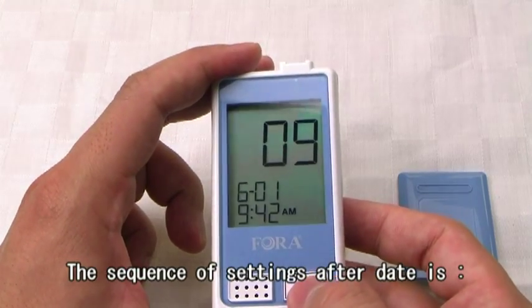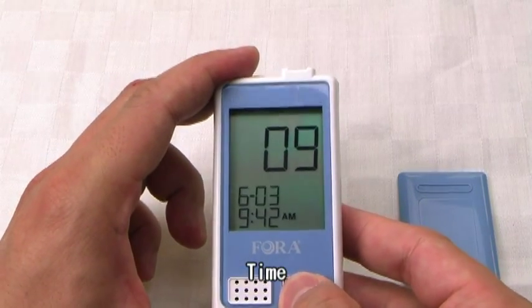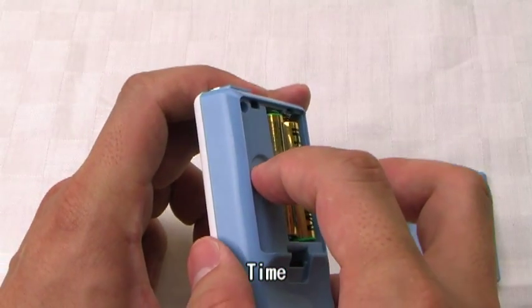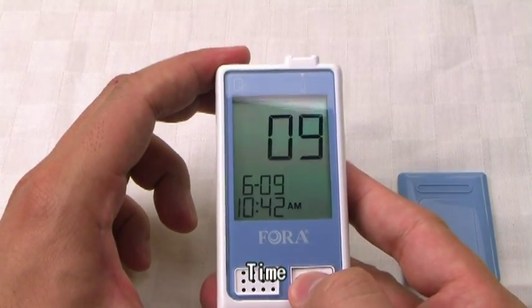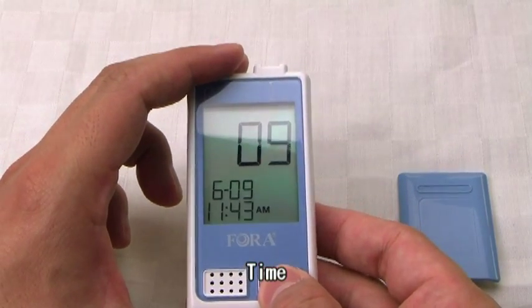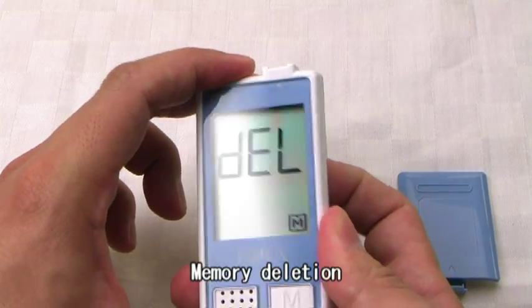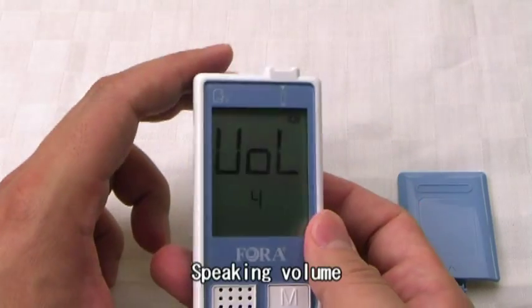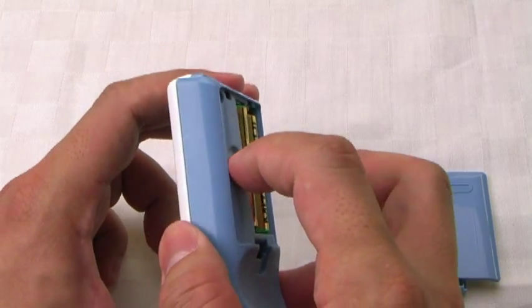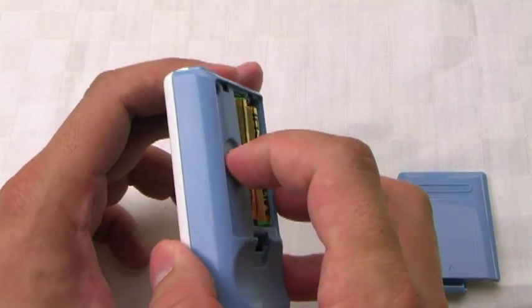The sequence of settings after date is: Time, Memory Deletion, Speaking Volume, and Language Selection.